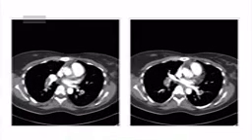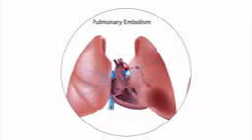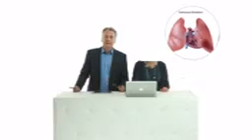You can see in the two branches of the pulmonary artery there are several thrombi. So this was a case of pulmonary embolism. And it clearly shows how echocardiography is important in assessing these patients. Now, if you have small pulmonary emboli, you will not see anything with echo. But if the patient has a massive pulmonary embolism, you will. So I think in summary, we can conclude this chapter with just a general conclusion.